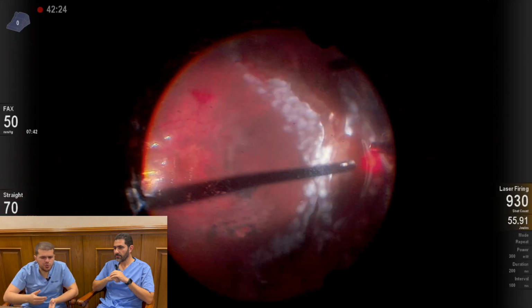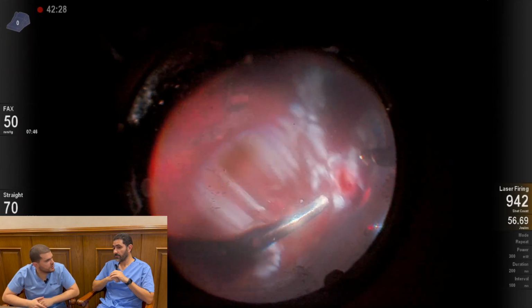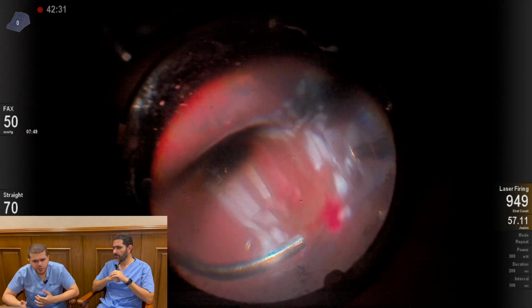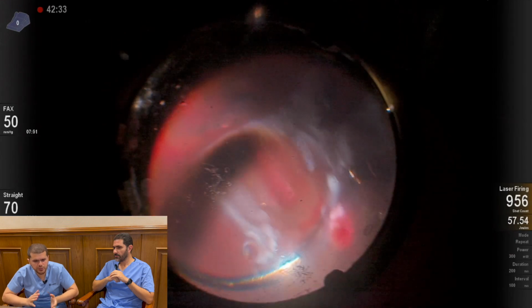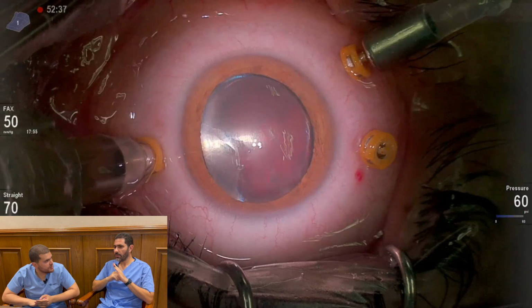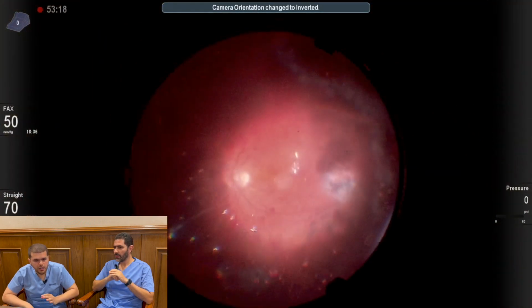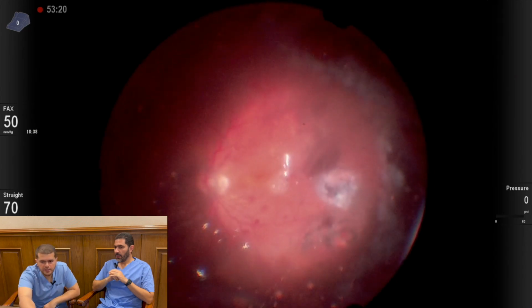How much slippage would you say is okay to leave? And if you find a large area of slippage, where do you put your limits? No, I cannot tolerate any level of slippage. So here there is some area in the temporal area that slipped a little bit.